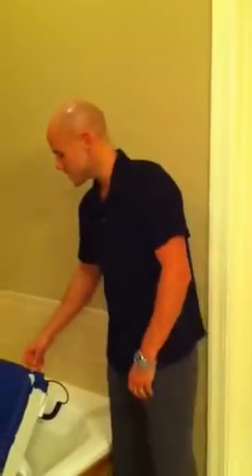Hello, my name is Wade Lawrence with Clark Healthcare. Today we are going to talk about our Aquatech line of bath lifts, starting out with the lift itself.